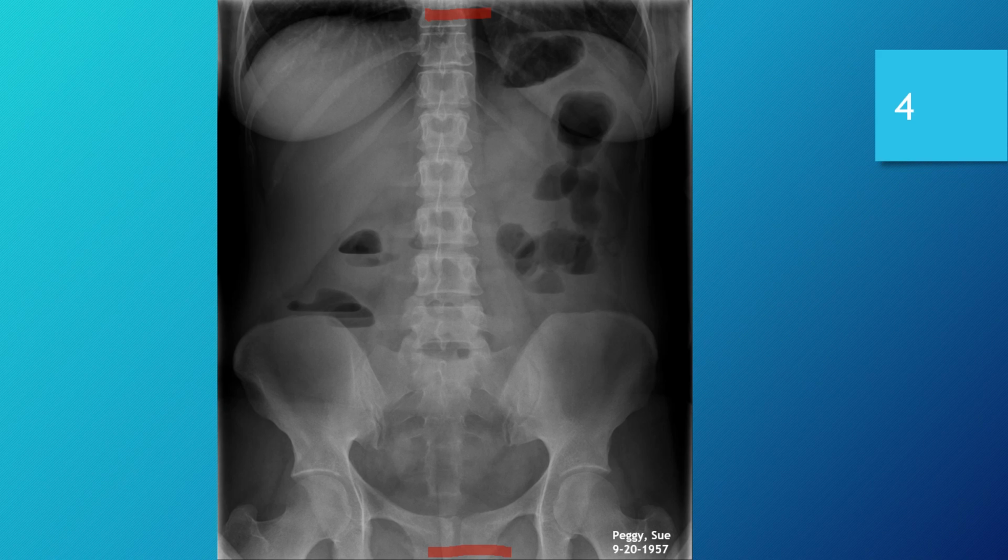And so the diaphragm must be included, and we can see across the upper abdomen here, there's the bottom of the lungs, the lung bases, and we have lung visible above that, right through there. So yes, we did get the entirety of the diaphragm in this image.